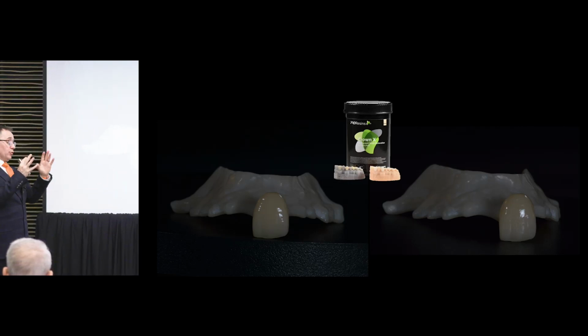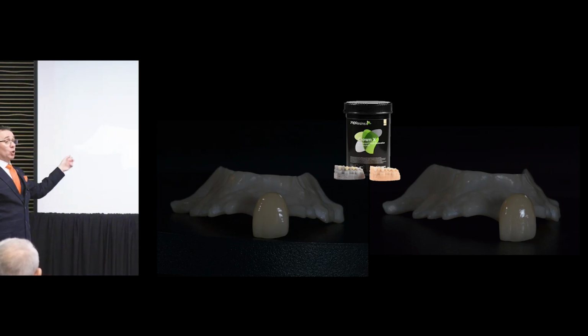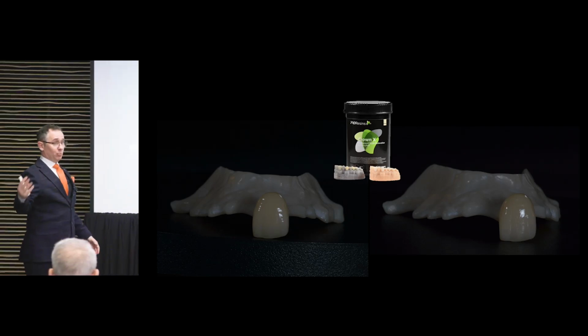So we use, for our provisionals, for our try-ins, anything that you're going to see in the bridges, we use a lot of this material. It's sold as a final. We don't use it as a final. We just use it as a good long-term provisional.